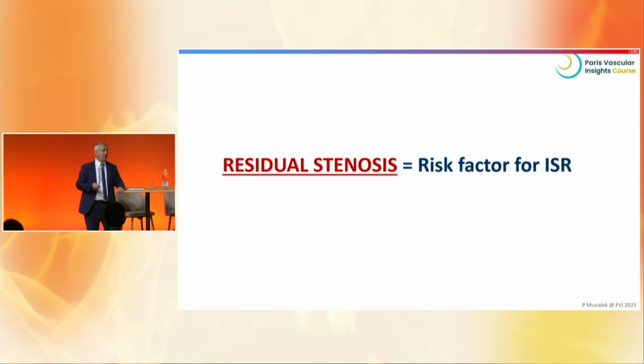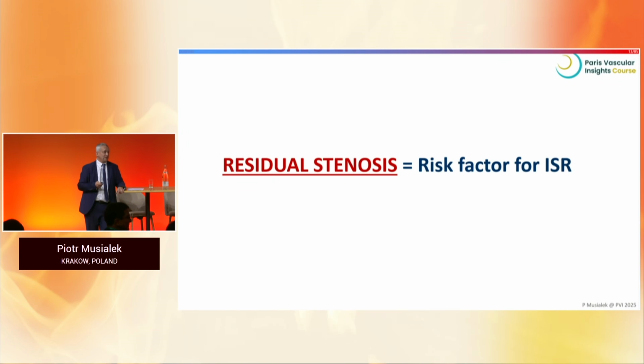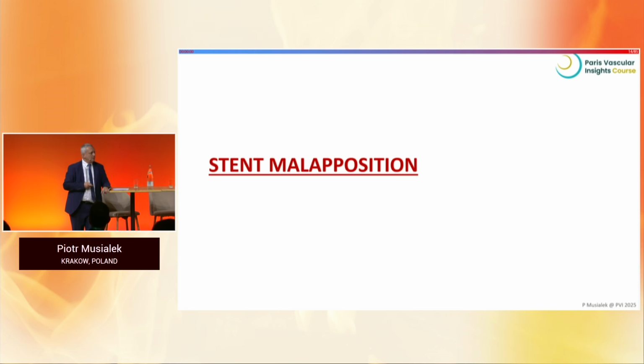So residual stenosis is a risk factor for in-stent restenosis. Paolo? Exactly. That's what you wanted to say. Exactly the reason why I don't like it. Okay. But how much? Stent malapposition. That's another issue that occurs with plaque that is not prepared. You heard about calcium from Professor Schneider.